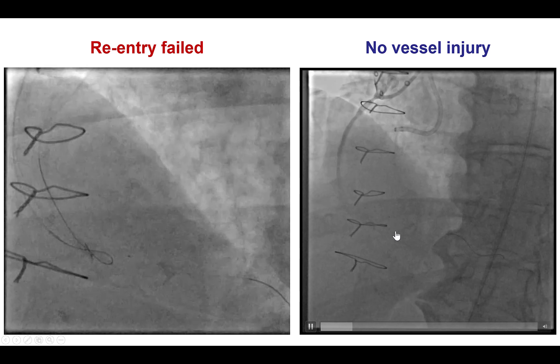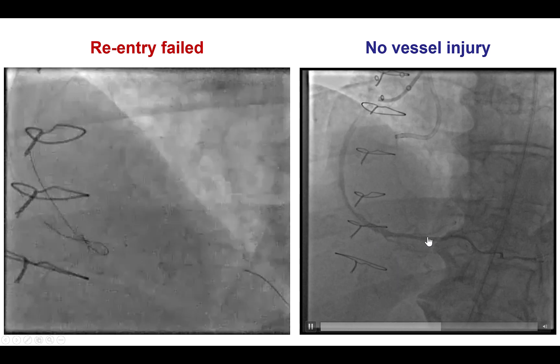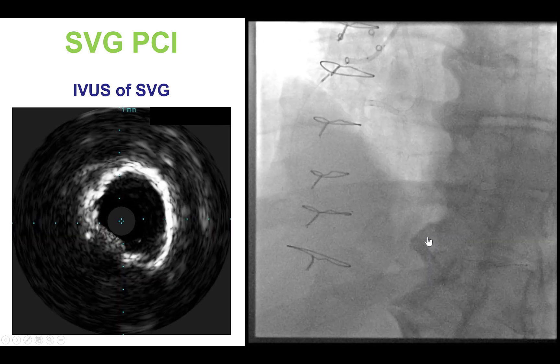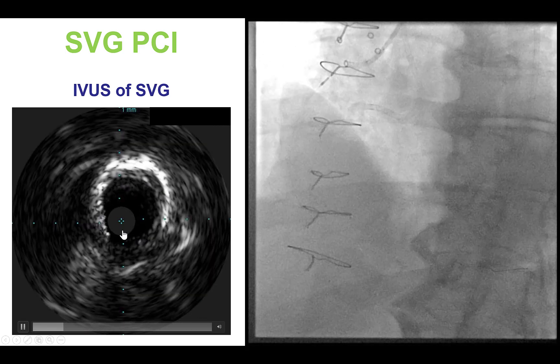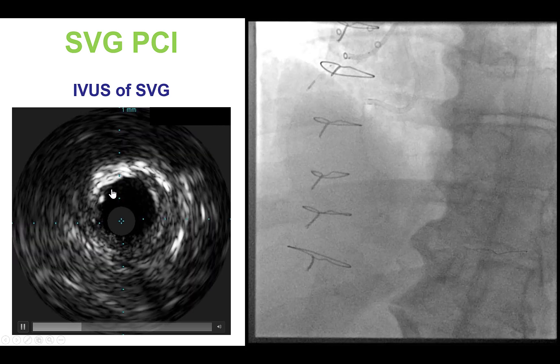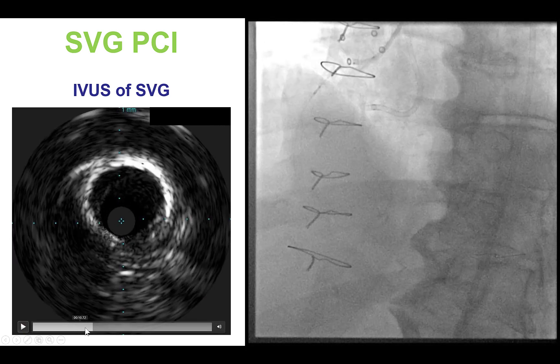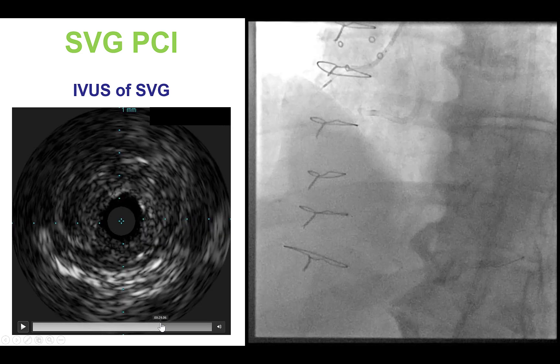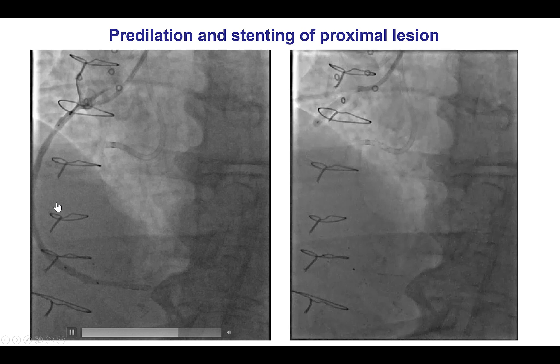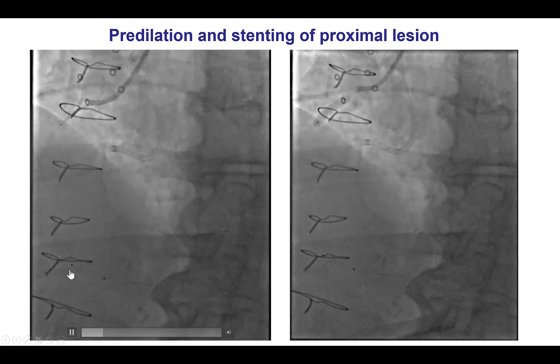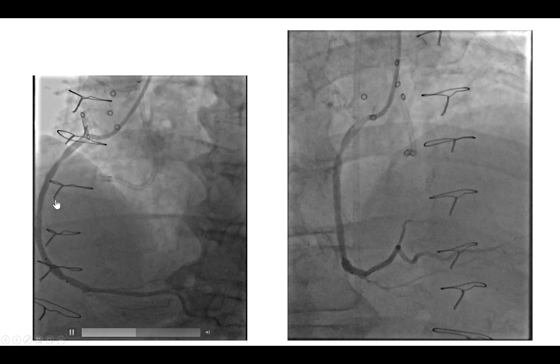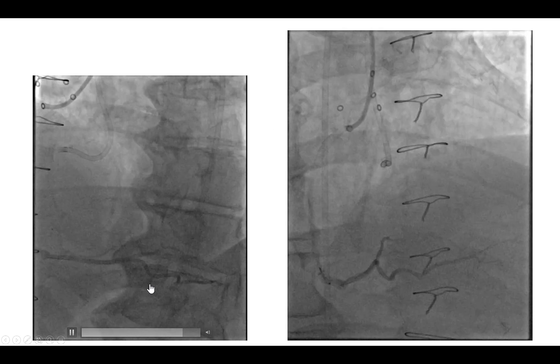Fortunately, there was no injury to the saphenous vein graft or the distal right coronary artery. After this, and given all the challenges, it was decided to stent the vein graft to the right coronary artery. Intravascular ultrasound showed some calcification as well as soft plaque in the proximal segment. A filter wire was placed, followed by stenting, which provided a nice result with TIMI flow into the right coronary artery.